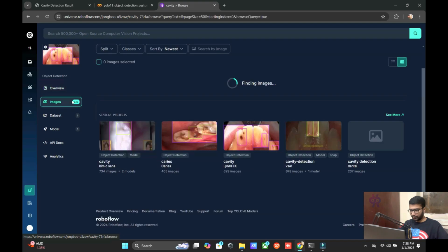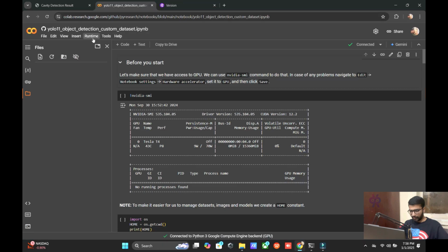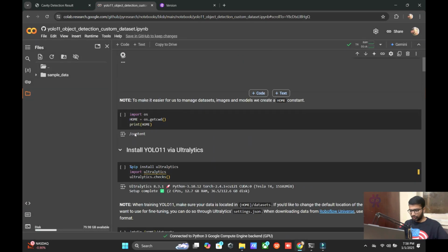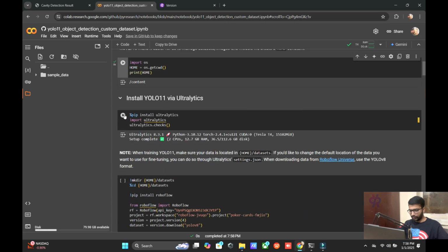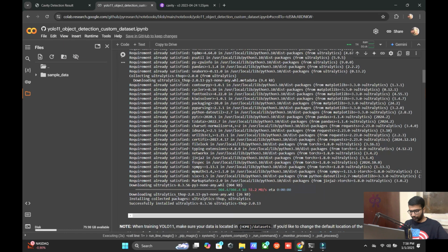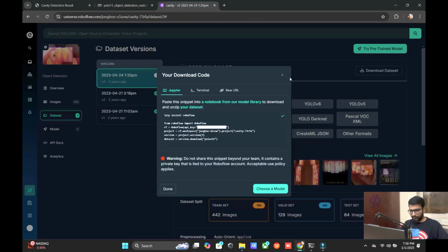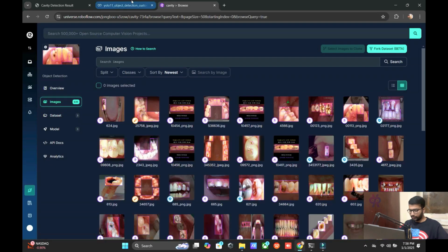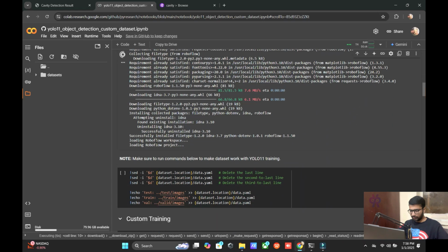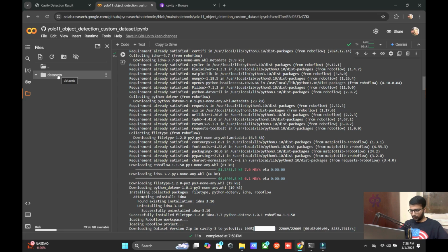Okay, so here I click download. Here select YOLO11 and show the code. Here in runtime settings, change the runtime to T4. Okay, initialize the GPU, make sure your home path is okay, and install YOLO11. Now we need to understand: we copy and paste our dataset link from RoboFlow here, and it's easy. So here the installation part is done, and after installation you can see the dataset is downloaded, and let me show you the folder here.